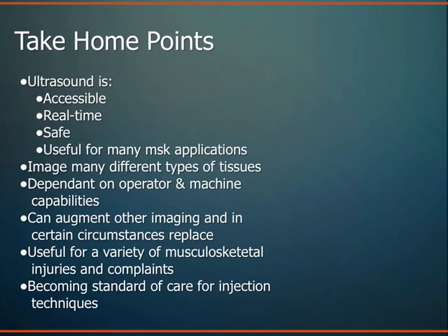You can image all kinds of different tissues, and it's important to keep in mind, as you're imaging those different tissues and looking for pathology, that you have to realize not only your personal limitations but also the limitations of the ultrasound machine, as you get more and more training and more comfortable with the modality. There are lots of instances in musculoskeletal medicine where this is as accurate as other imaging modalities, and in some cases can even replace those modalities, and in some cases is even better for imaging some tissues.